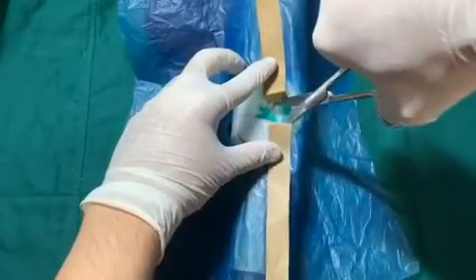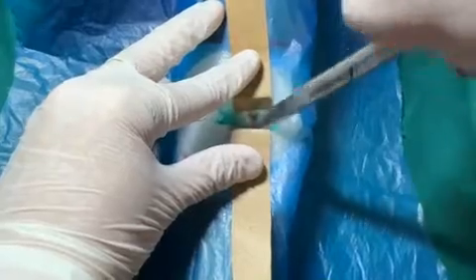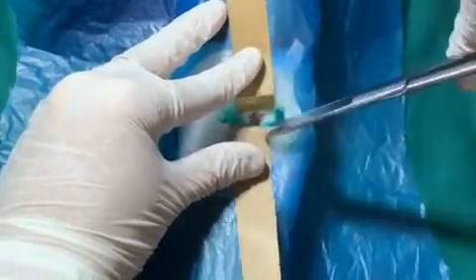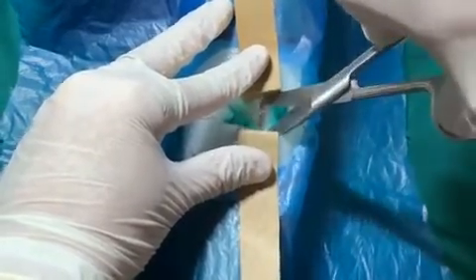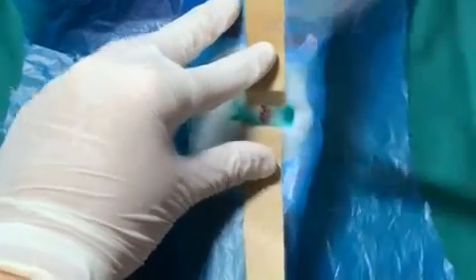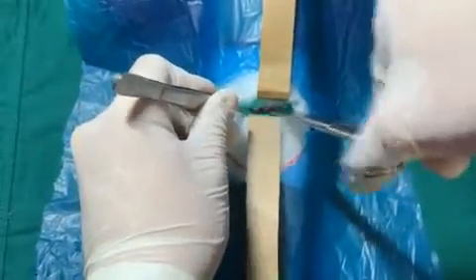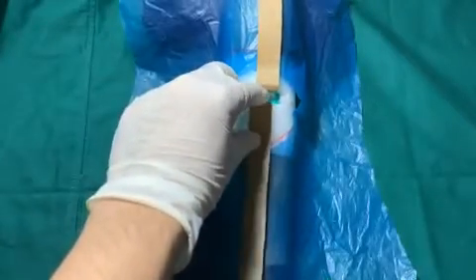Dissect the trachea by parting the tissues with scissors. Remain strictly in the midline in a vertical plane to avoid injury to the inferior thyroid veins. You can now identify the midline cervical fascial plane between the sternal hyoid muscles. Divide this intermuscular plane by spreading with a pair of scissors. Repeat this maneuver to separate them and retract the muscles laterally. The trachea and cricoid can now be palpated.